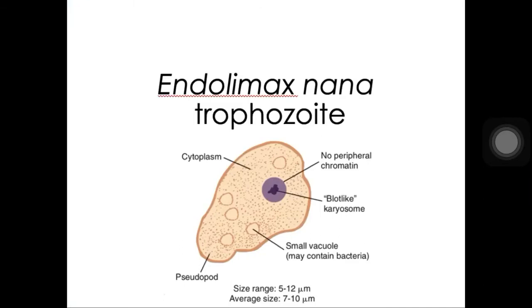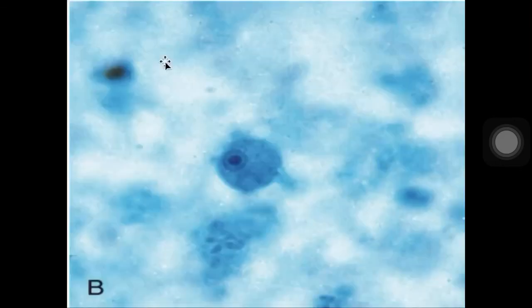Okay, unang-unang kailangan tandaan sa mga amoeba po na walang Entamoeba sa name nila, like for example, Endolimax nana at saka Iodamoeba buetschlii, wala pong presence ng peripheral chromatin. So wala silang presence ng peripheral chromatin, kaya as you can see here, wala pong presence ng peripheral chromatin. Ayan, pag-zoom natin. So walang presence po ng peripheral chromatin. Dito rin po walang presence ng peripheral chromatin.